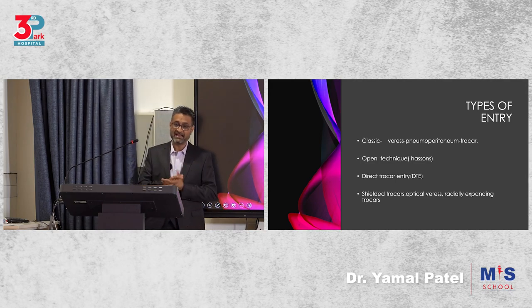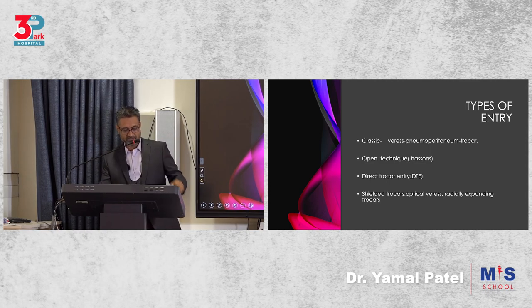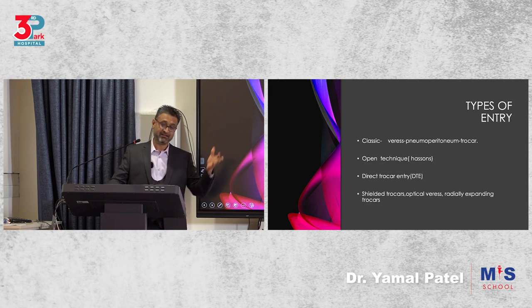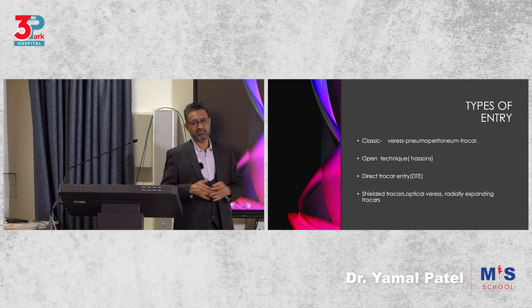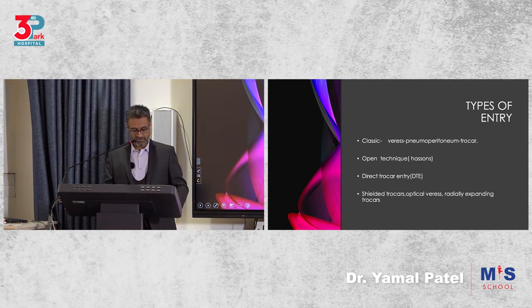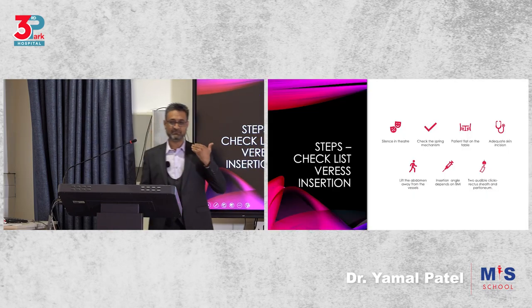We have the following types. We have the classic Veress needle pneumoperitoneum, then trocar entry. Then we have the open technique, which is Hasson's. And we have the direct trocar entry, which I told you I use. And then we have the optical entry, where you would go in with, let's say, the camera attached to your trocar and go in together under vision.